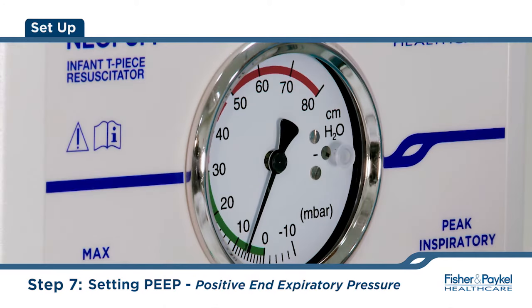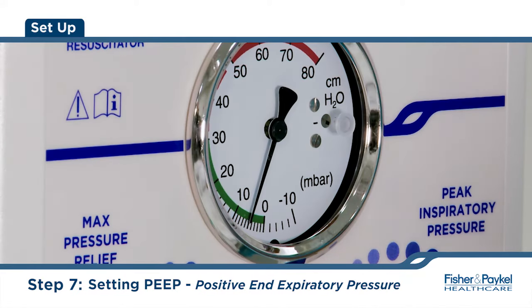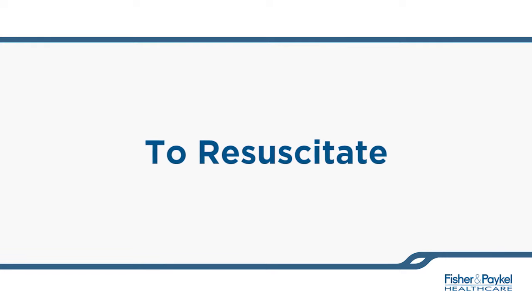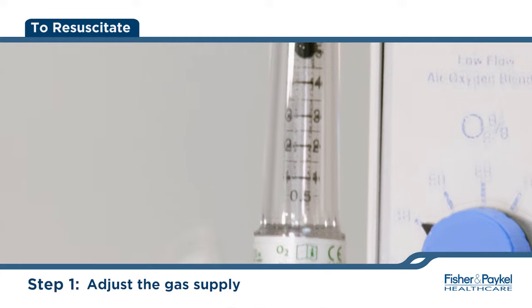Adjust the PEEP cap to the desired PEEP level. Adjust the gas supply to the desired flow rate.